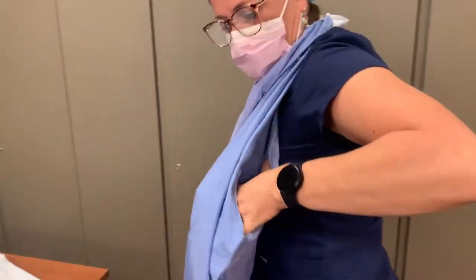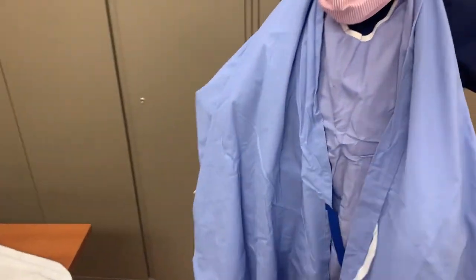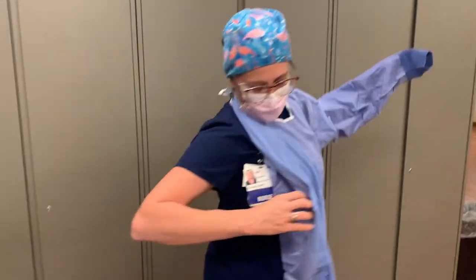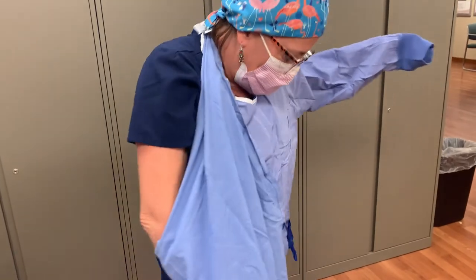Locate the sleeve openings. Insert one arm into the sleeve and extend your arm through. There is another gown tie still tied together in the front — when you extend your arm, make sure that you lift the arm above this tie. Insert your second arm into the sleeve and again extend it, making sure that you lift your arm over the tie.